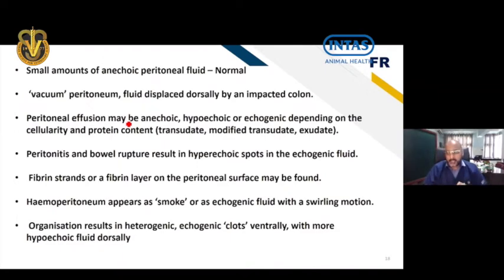The other beautiful thing with equine ultrasound is that when you find fluid, you can do ultrasound guided abdominocentesis. You can see the fluid, the color of the fluid, and you can send it for cellularity also. So that is one of the things which can be exploited using sonography in a very safe manner.